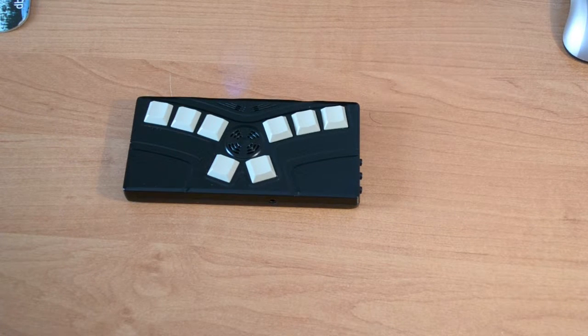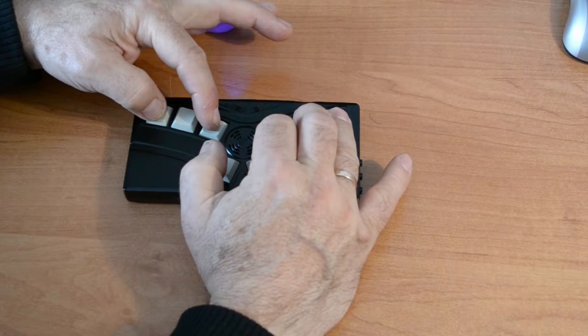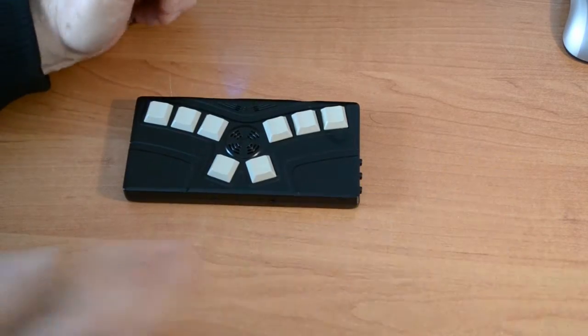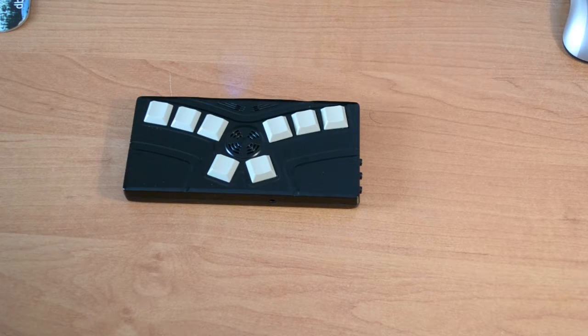Because this list is empty, the device is asking us if we want to add a new device to the list. Yes, we want to add the new device to the list, so we answer yes, pressing the letter Y, dots 1, 3, 4, 5, 6. Start the connection process on the external device. Okay, now we have to start the connection process on the external device.